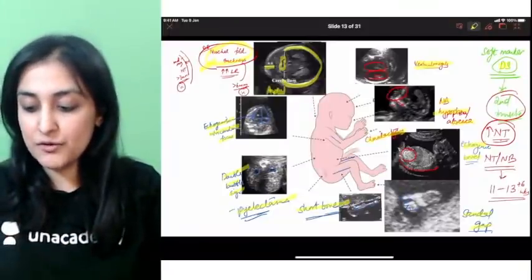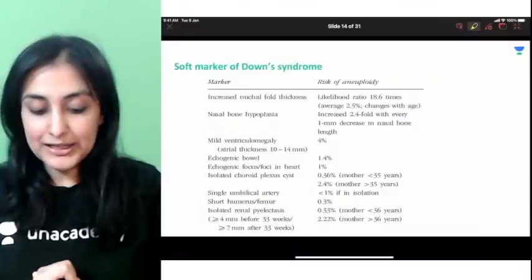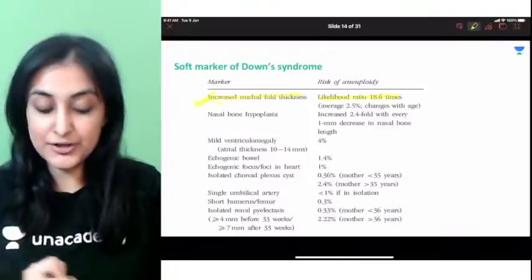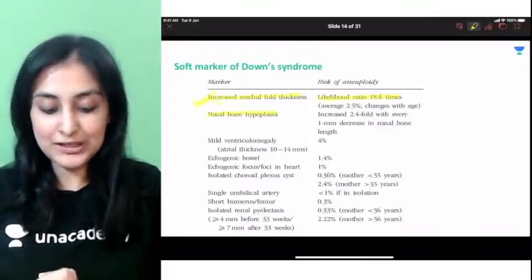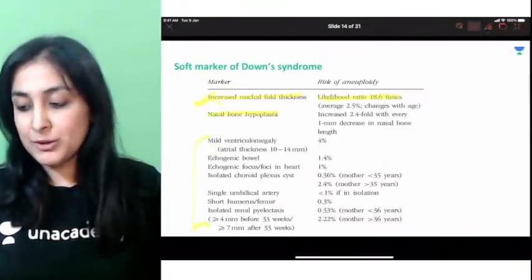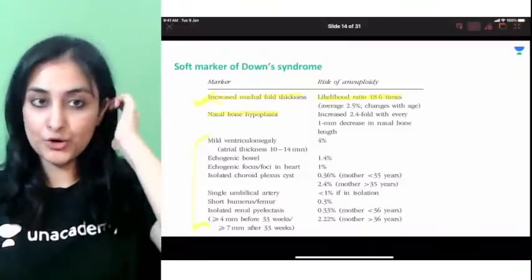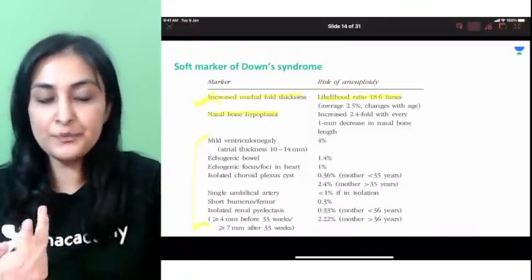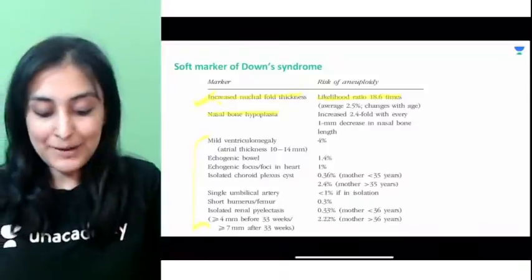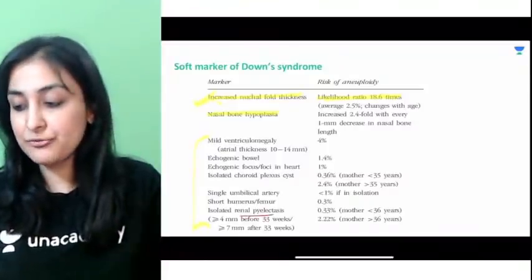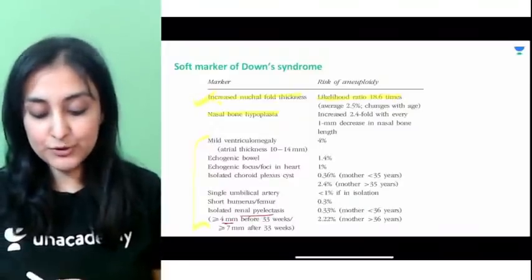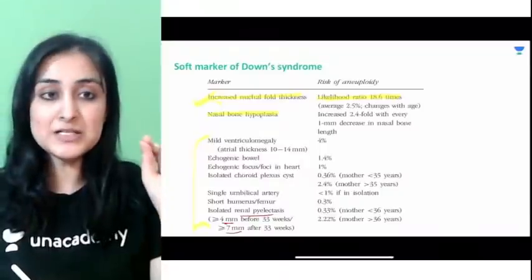To summarize Down syndrome soft markers: increased nuchal fold thickness has the highest likelihood ratio, followed by nasal bone hypoplasia, then others. All need not be present — you can have one or more. The more markers present, the higher the risk, but even a single marker warrants confirmation. NFT >6 mm; pyelectasis means renal pelvis dilation >4 mm before 33 weeks or >7 mm after 33 weeks.